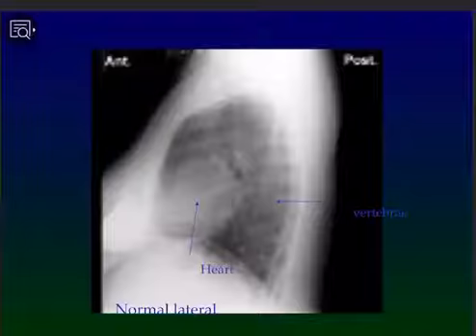Okay. Now this is a lateral view, standard lateral view, but you see here anterior and posterior are already written. Even if not written, you know that this is the sternum bone, and behind the sternum is the heart shadow. And what is in front of it? This is the breast shadow. This is the X-ray of a female patient.